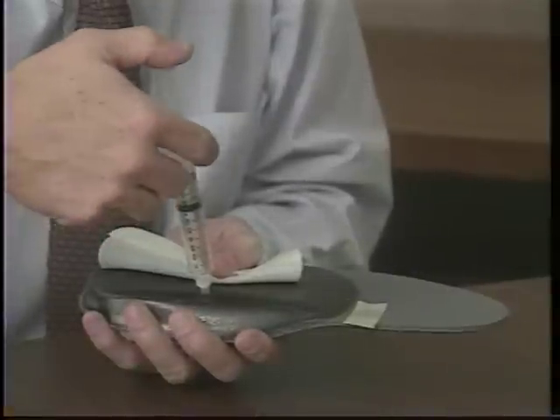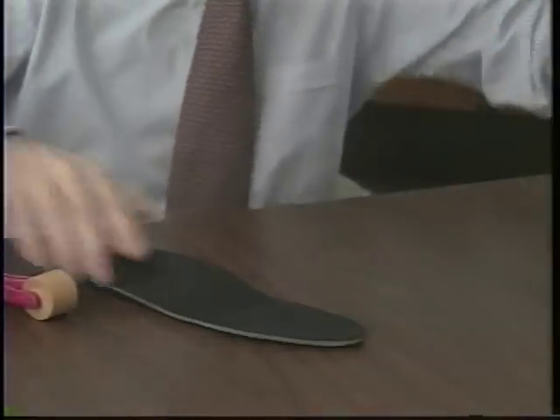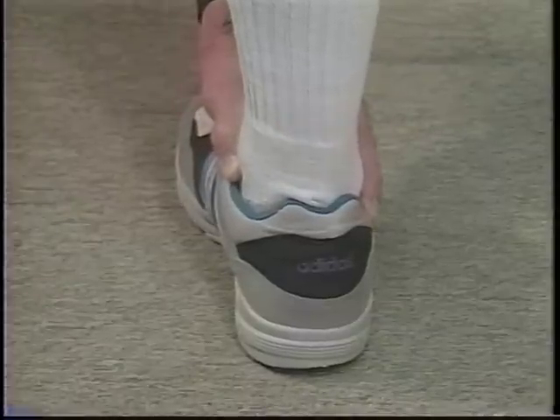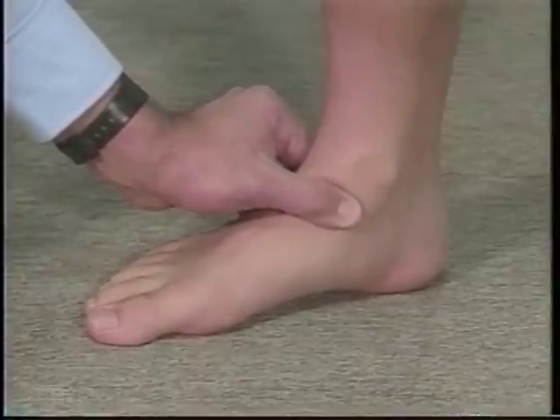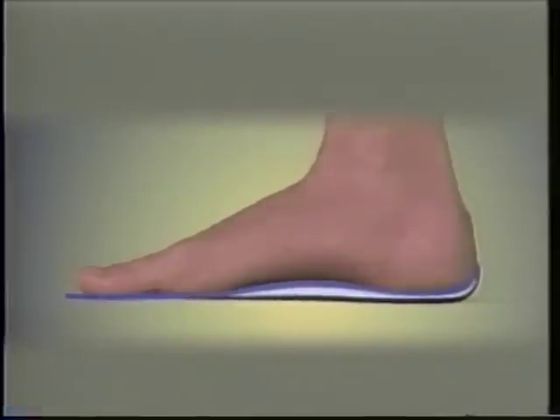The molding of the BioThotic is done with an innovative technique which allows the construction of a functional orthotic in the weight or semi-weight bearing position. The foot is aligned in neutral position during the molding process, creating a space under the foot which is filled with expanding foam to build a neutral position impression of the foot.